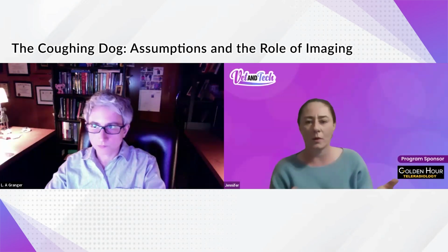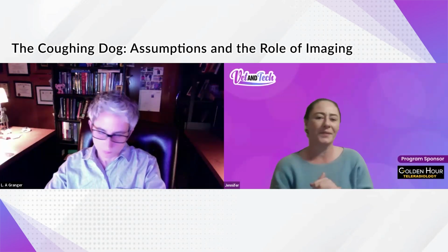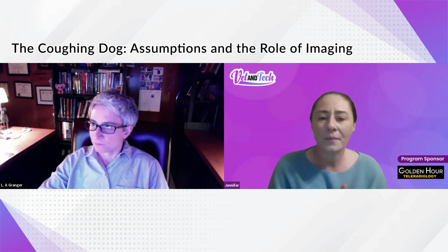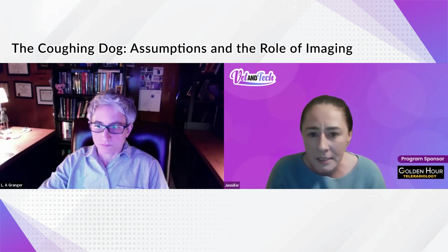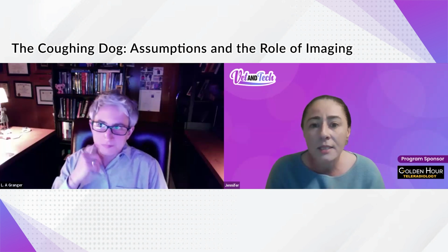Thank you so much for such a wonderful presentation tonight, Dr. Granger. Thank you. So our first question of the evening is, is mild dilation in a bronchus considered bronchiectasis, or does it need to be pronounced? And when is dilation considered too much?